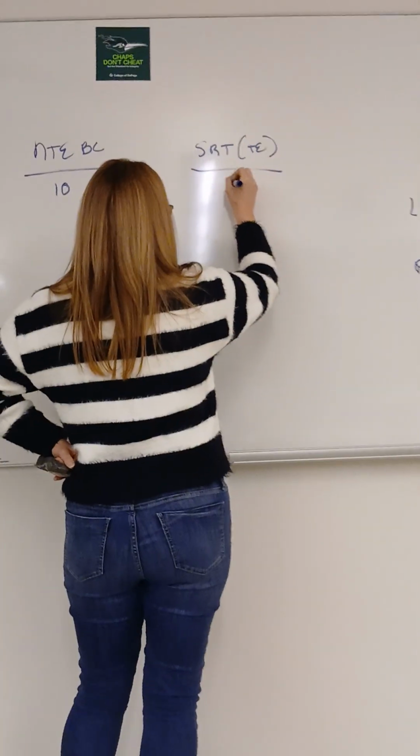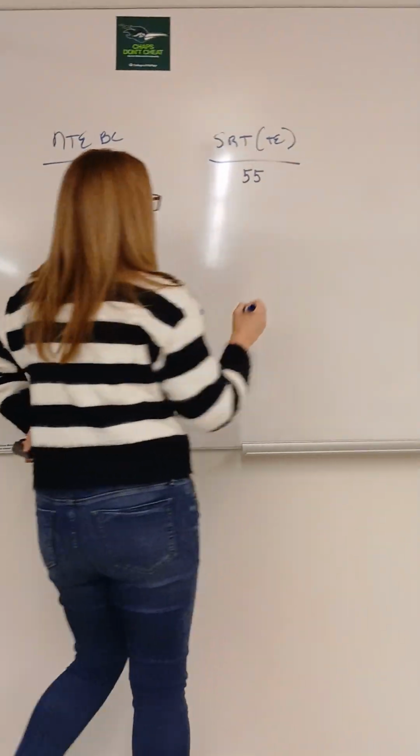Okay. So let's say our non-test ear bone conduction, we're using headphones, and our SRT, that's here. Let's say our non-test ear bone conduction is 10, and our SRT for our test ear is 55.